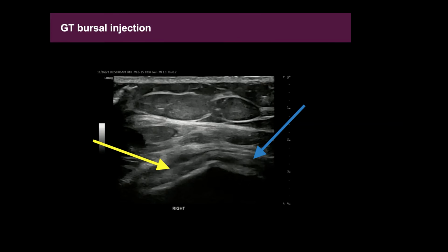So that we could say, okay, the tendons are intact, and we also gave this patient a greater troch bursal injection. If the patient's still in pain, now we've ruled out two things at once. That's one of the benefits of ultrasound: you could do a diagnostic exam and also a diagnostic injection at the same time, if it's warranted.